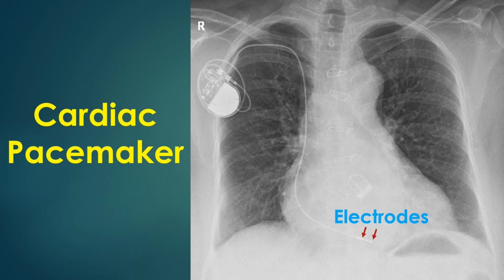It needs a higher resolution photograph with more penetration or ideally a fluoroscopic imaging to bring out the details of the lead tip well. This X-ray also shows a Starr-Edwards aortic mechanical prosthetic valve and sternal suture wires. The aortic position of the valve can be identified by the upward direction of the cage. In Starr-Edwards aortic prostheses, the cage is seen upwards with 3 struts and the sewing ring at the base.